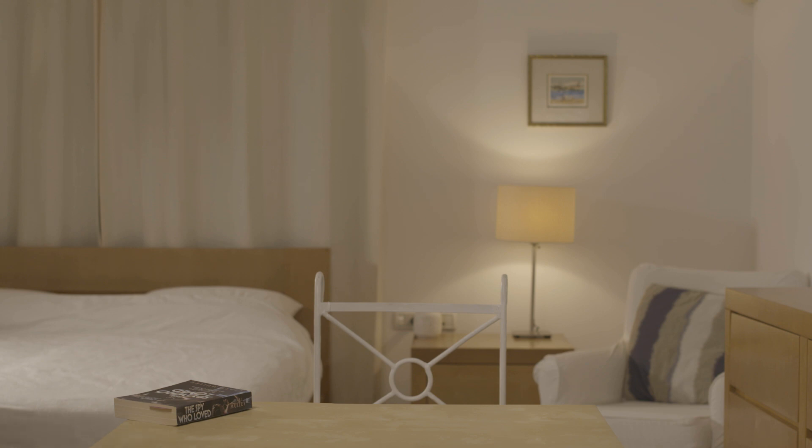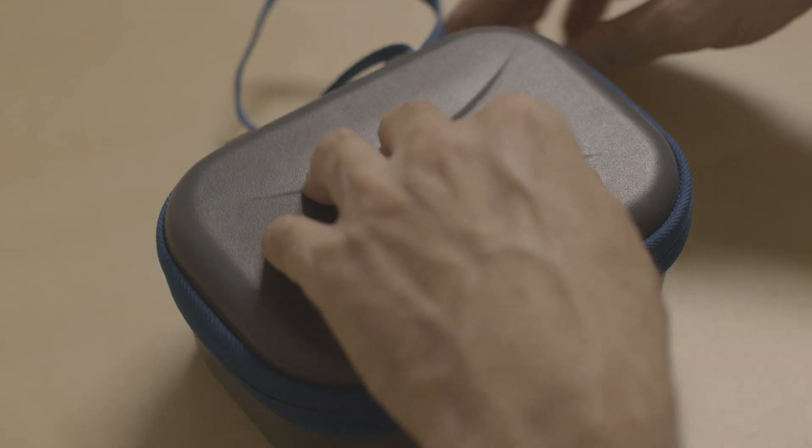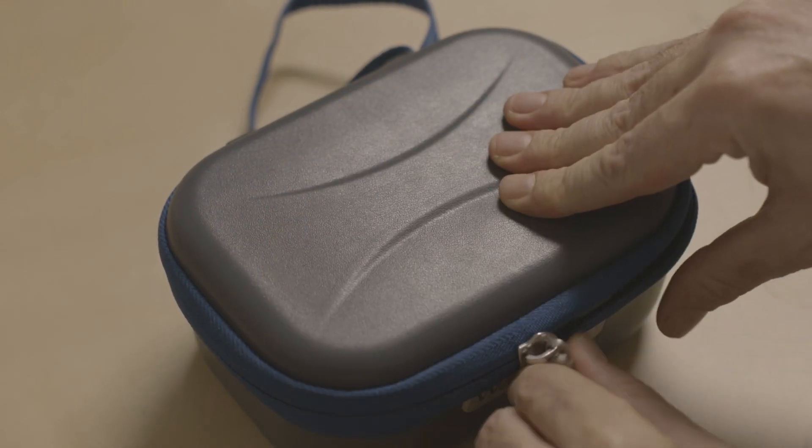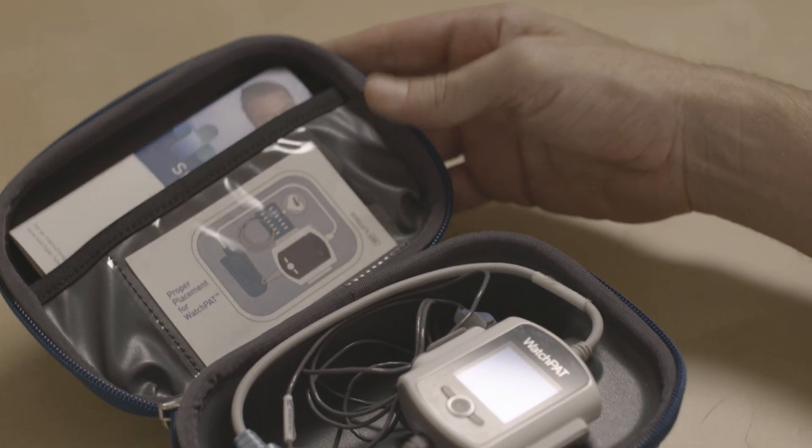This brief video will show you how to correctly put on and use the WatchPAT home sleep testing device. You should put the WatchPAT device on when you are already in your pajamas, just before getting into bed. Open the WatchPAT case. You will find a helpful illustrated guide in the side pocket.